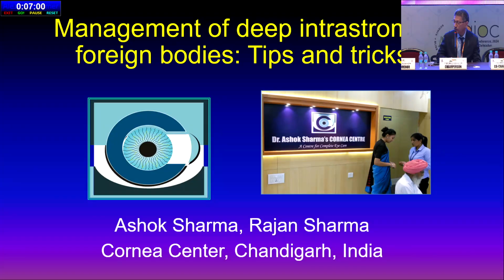Dr Ashok Sharma from Chandigarh. Tips and tricks for removal of deep stromal foreign bodies.